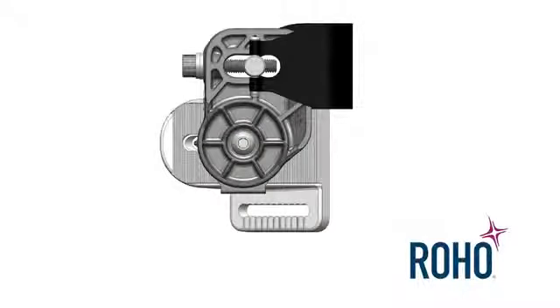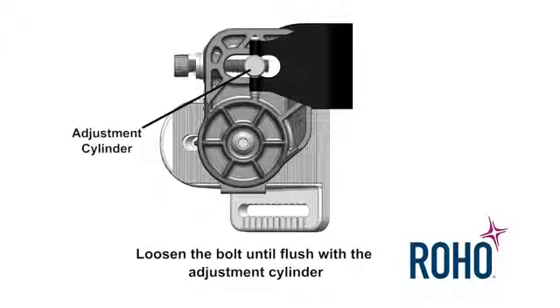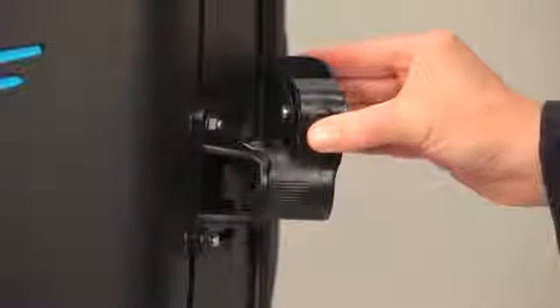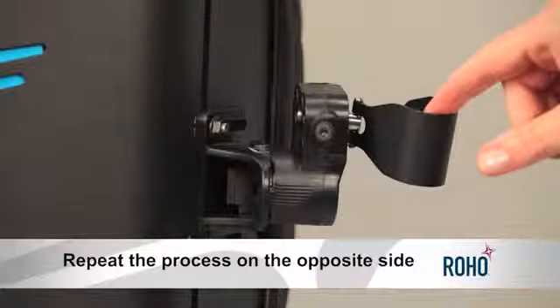To simplify this, view the hardware from the angle shown here. Loosen the bolt until flush with the adjustment cylinder, but not removed from the hardware. With the bolt in the desired place, as shown here, push the back cane band toward the bolt to unclip. Now, fully open the back cane bands by flipping them, like this. Repeat on the opposite back cane band.